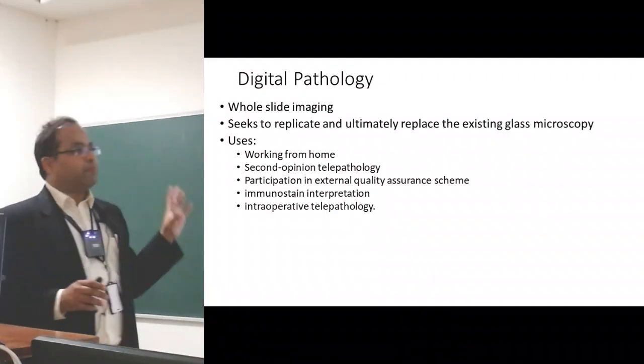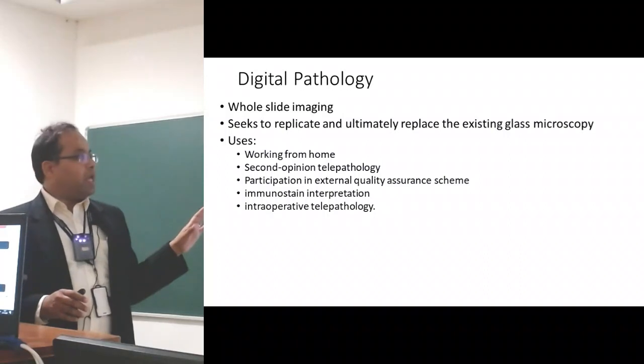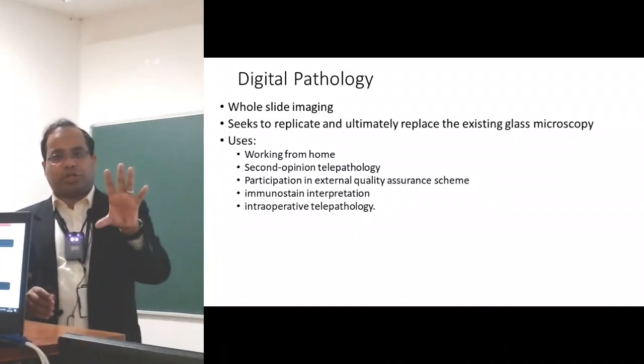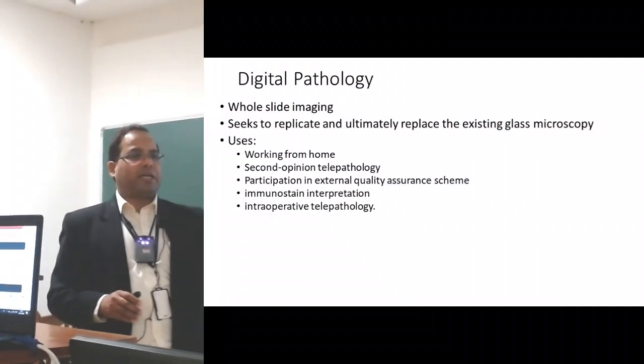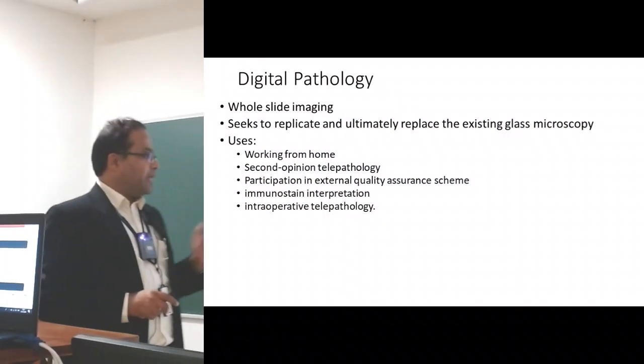It can be used, suppose you can do it from your home, the entire workload, and second opinion, telepathology. So you can send a scanned picture to any expert, whether he's sitting in US or UK, and that person can give us a diagnosis or an opinion about the case from there.